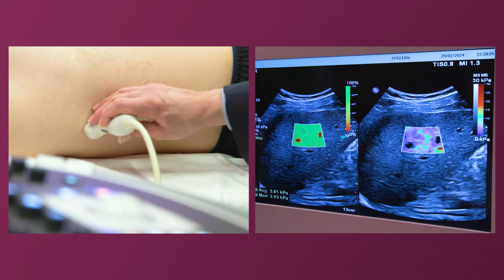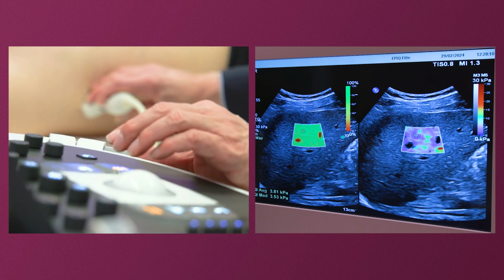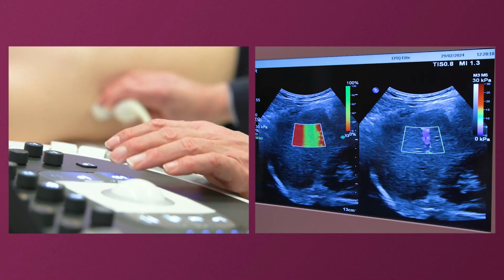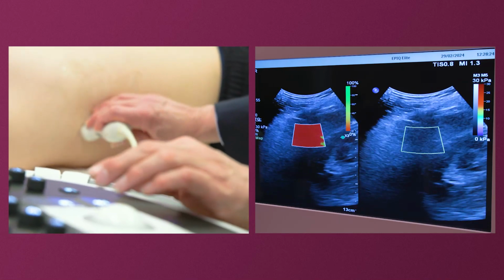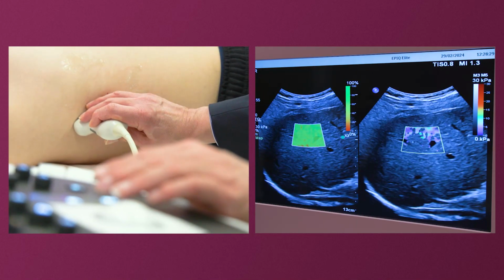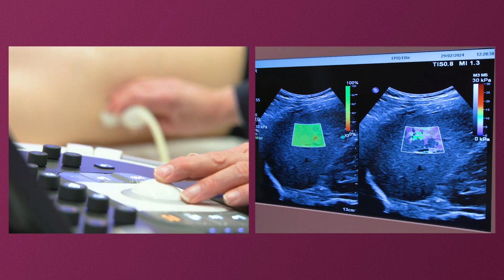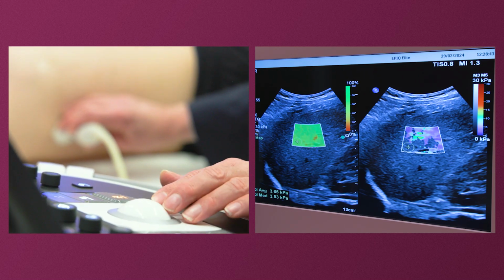And again, when you press enter, it'll enter it here, and you can do it 5 times. Okay? 5 times. Five measurements. No, stop, stop, otherwise it's cheating. Take another measurement. Yeah. And you see how this one is not so good, and the confidence map shows it's not good, okay? And even though it's not all, this is fine, because you know that you've got one area that is okay, so you can make that measurement from there. Yeah, but you're not going to make your measurement from here because it's not accurate.